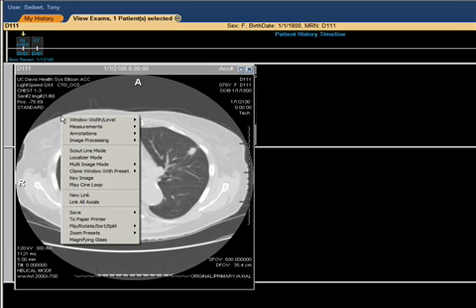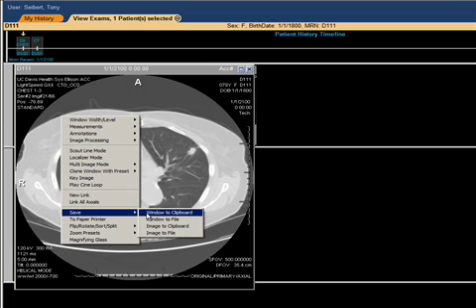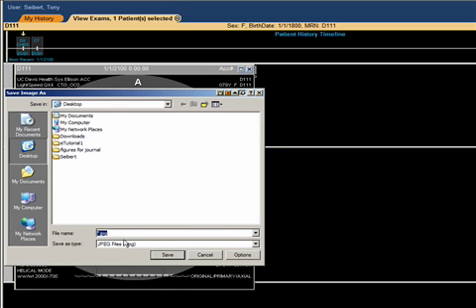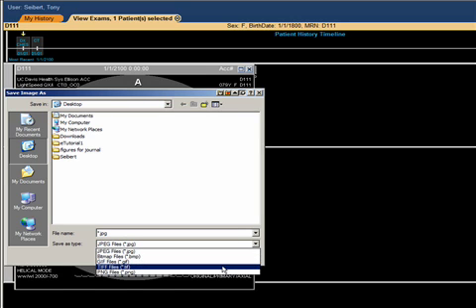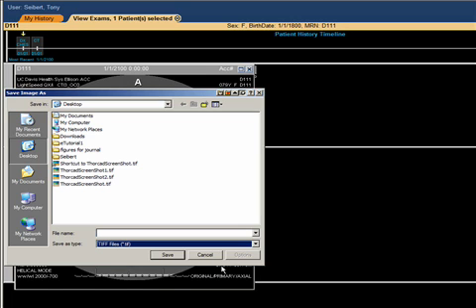The next step is to save the image to the disk. For this PACS, we use image to file. Because I am not sure of what, if any, JPEG compression is performed on the file, I choose to save this as a TIFF file instead.